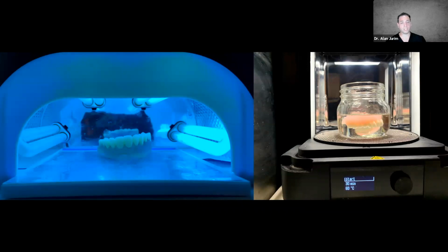The benefits of the 3D printed dentures are that they're easily reproducible. And we try to use that aspect of it to influence a lot of the other denture workflows that we have within the practice. For example, what we see here, this patient had come to us and ultimately she's going to have a new upper and lower set of dentures made. The lower denture is an overdenture. But the upper denture, her primary concern with the upper denture was not aesthetics. It was nothing other than the fact that the denture was loose over time.